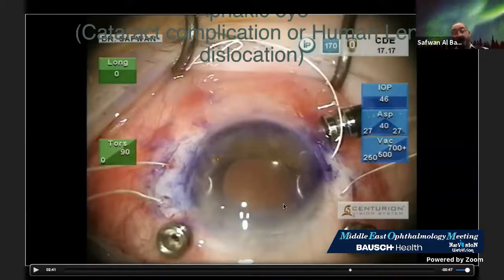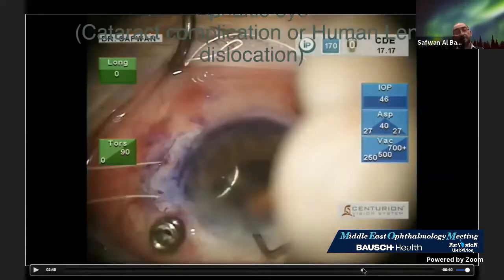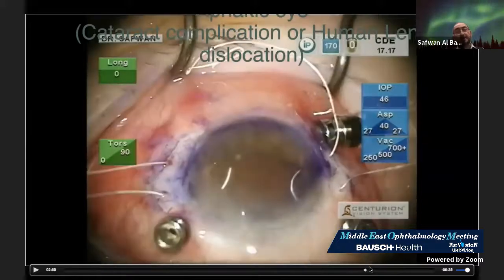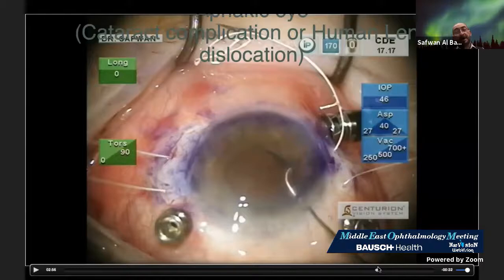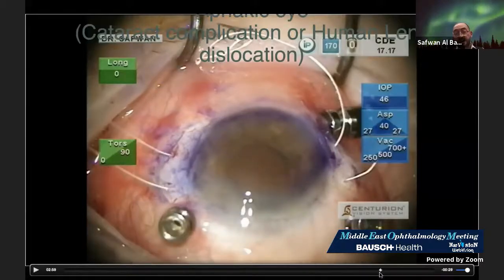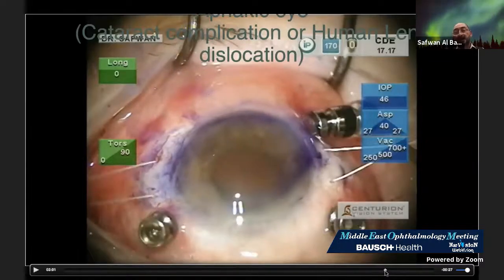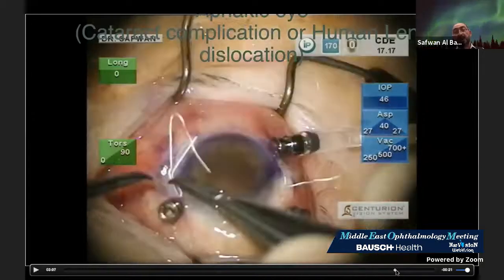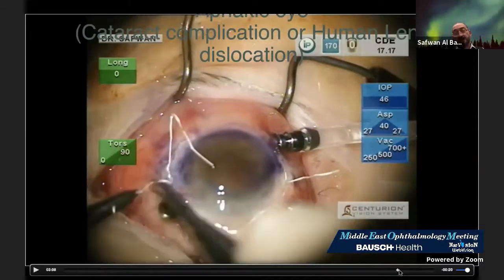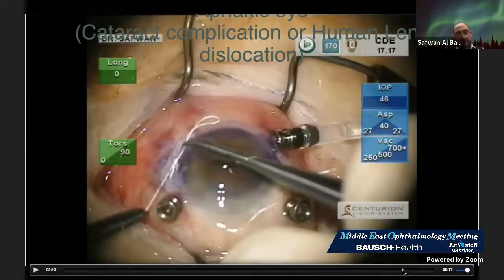Easily pushed back to the iris, so it will be back here safely. There's no touch, no need for a measurement. Here, the other two eyelets in, and now we are finished. The lens, as you can see, is centralized. Now, with simple, gentle tension on the suture, it's centered, and then now the tying. 1, 2, 3, and then that's all. We don't need to create any tension.